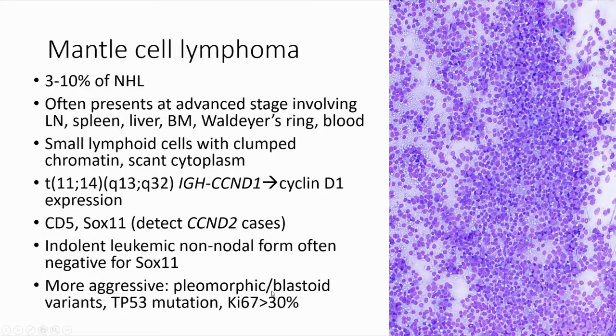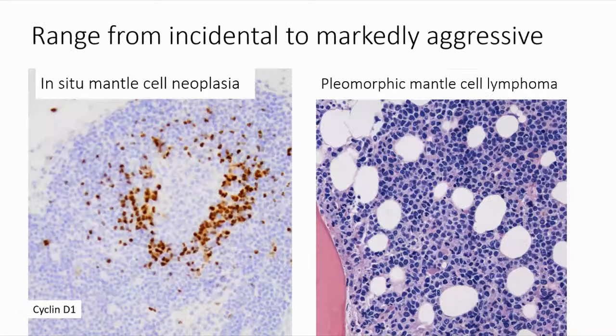And in most small B-cell lymphomas, like I said, I like to measure Ki-67, and it gives me an idea of the pattern and the overall architecture of the tissue, but we usually don't use it from a prognostic standpoint. But in mantle cell, we do. It's one of the ones where we do report out a Ki-67 proliferation rate associated with a more aggressive course. But as I said, in the typical presentation of mantle cell lymphoma, you may have diffuse involvement, medium-sized cells, but you can have a huge range.